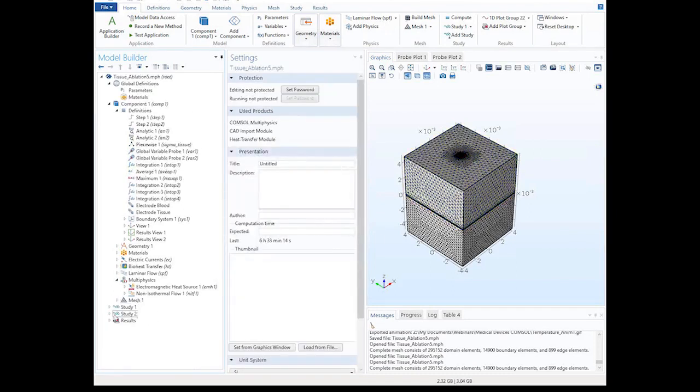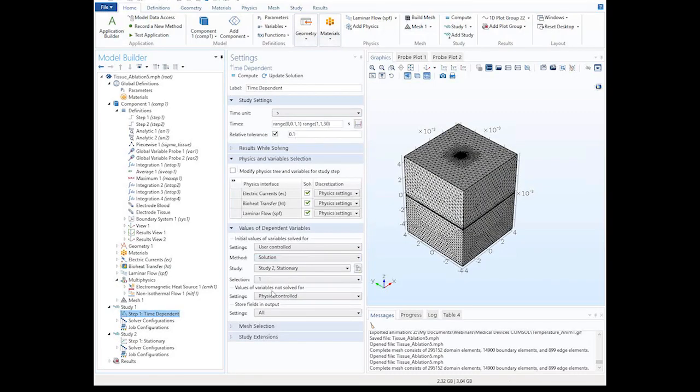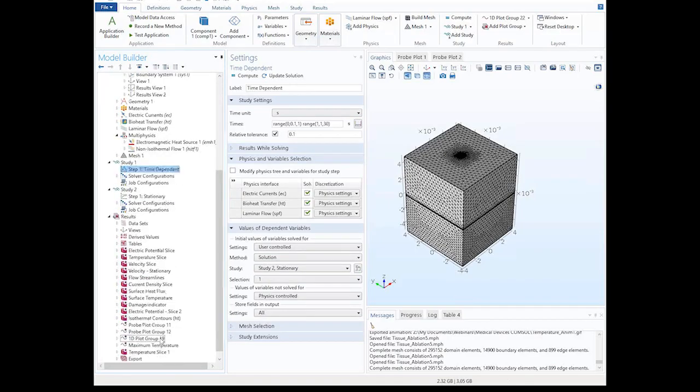And then the studies. The first was this stationary study, and that links to the second study, which is a transient study, which goes from 0 to 30. It uses the results of the stationary study. Pretty straightforward to set up. And then the results, many of which you've seen in the slides I showed earlier.